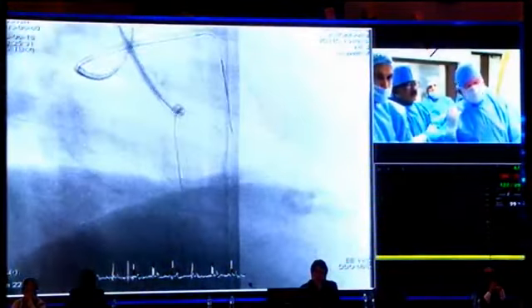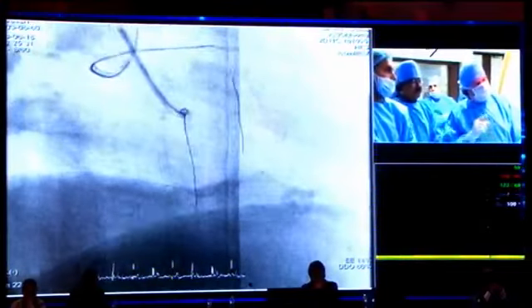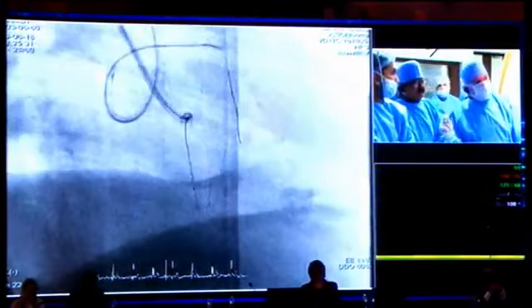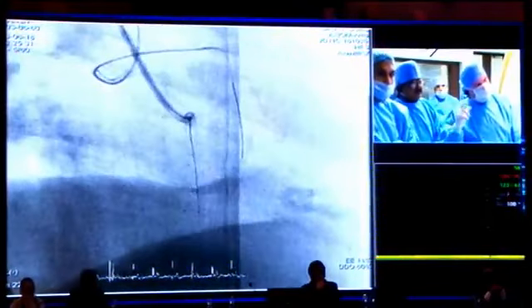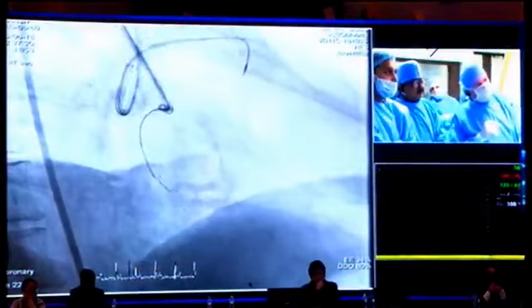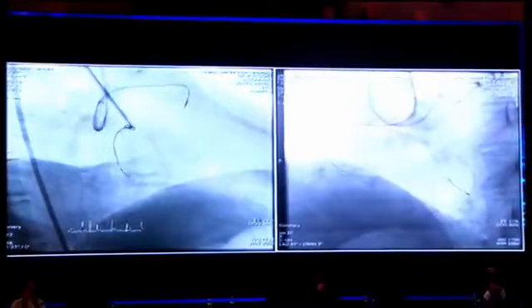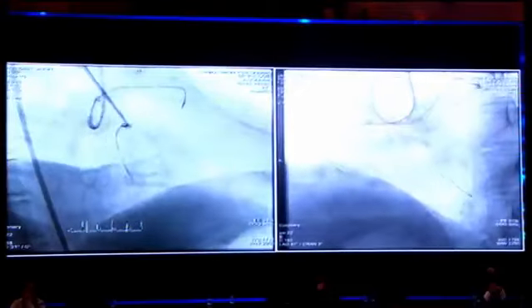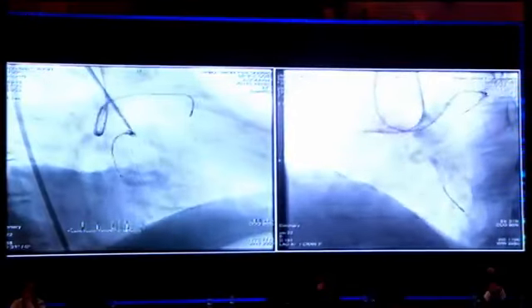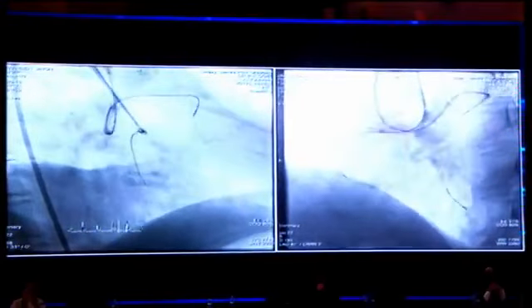Of course, we must remember that at the end, we should post-dilate the stent again. And it's important to have a safety wire down in case anything happens. Then I tried to do a selective shot. The Sion Blue was for collateral access. This is the selective injection, and that's where we are. We haven't done anything, so you tell us what we should do.